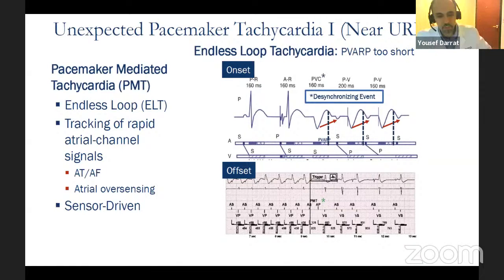I'm not aware. So if his EF doesn't improve in 3 months, what do you do? Do you reopen the pocket? I do. I open the pocket and I pull the pacemaker lead and I put in an ICD. I'll find the paper and share it with you so you can go over it.